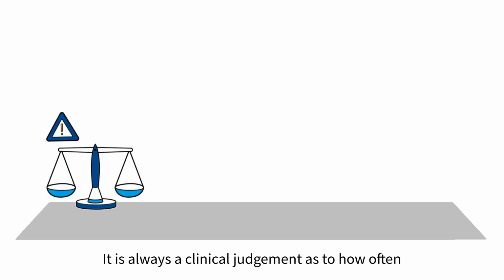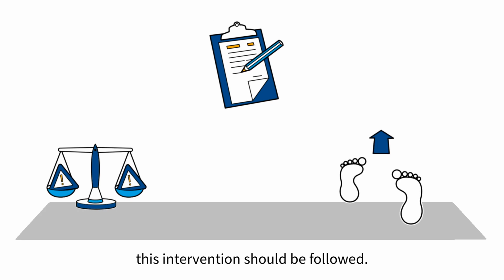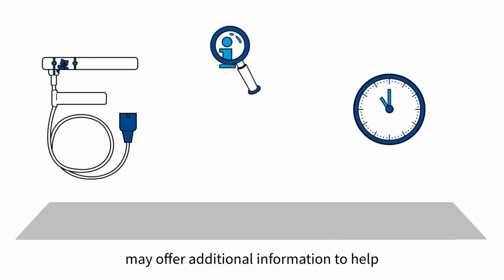It is always a clinical judgment as to how often to suction, and the institution's protocol for this intervention should be followed. External monitors, such as SpO2, may offer additional information to help determine the best time to suction for the baby.